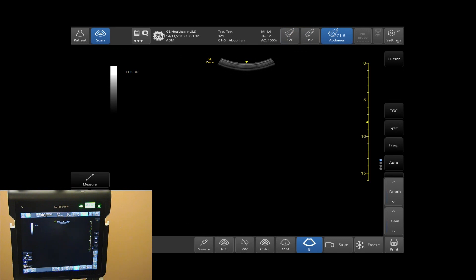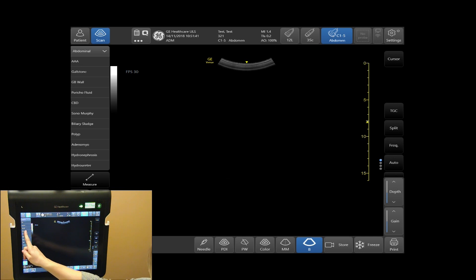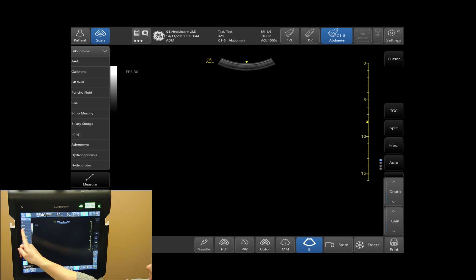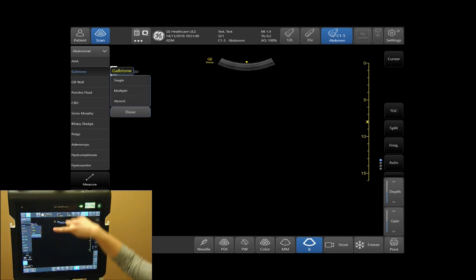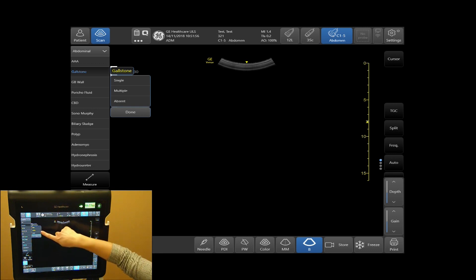To add findings, select your findings tab on the bottom left-hand side of your touch screen. Tap and select your findings from the list provided. In this case, I will select gallstone. Three choices will appear: single, multiple, or absent. In this case, I will select multiple.